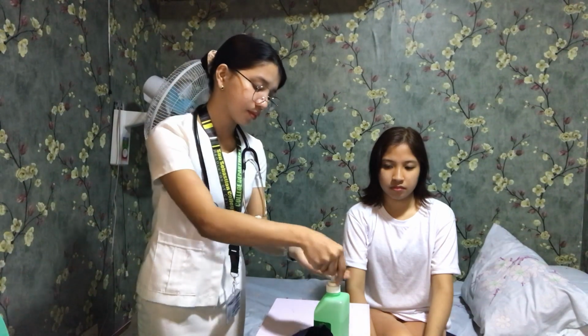Okay, now I already have her blood pressure, so I'm going to fully deflate the cuff and disinfect it to reduce the risk of cross contamination. And of course, I'm going to perform hand hygiene, and document the data that I have gathered in my patient's TPR sheet.